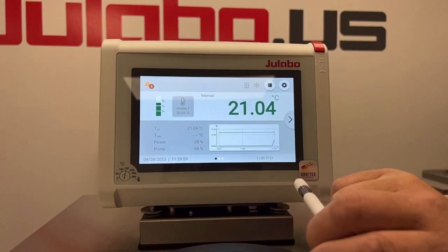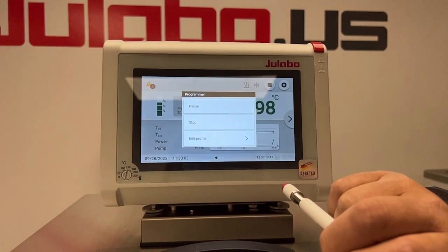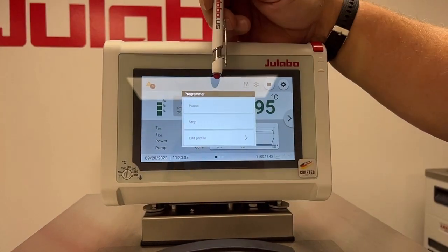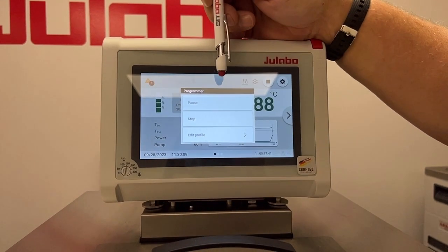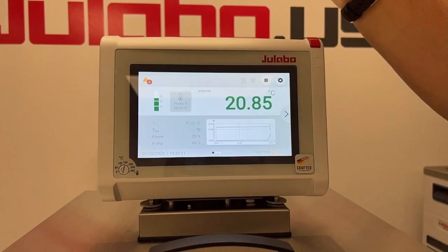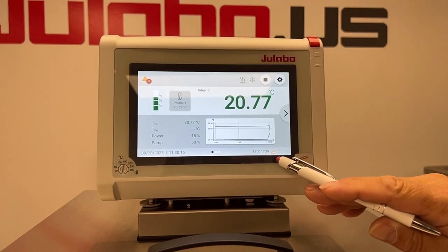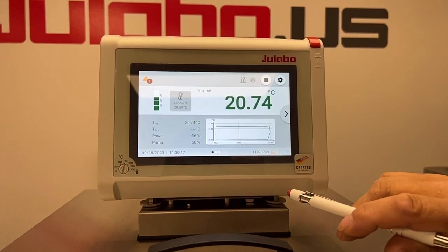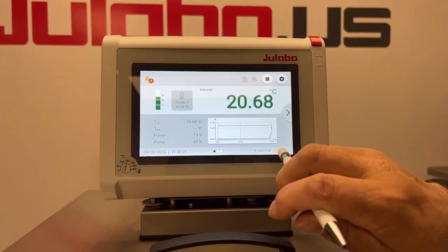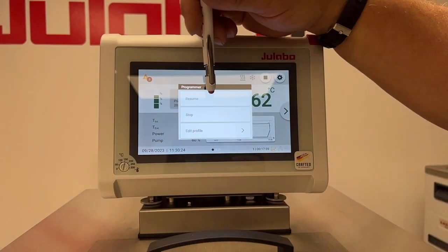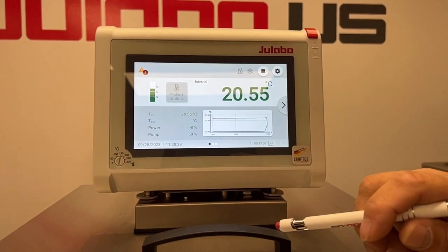So if for any reason you wanted to pause a profile, you press the flashing symbol, and you can pause, stop it, or edit it on the fly. If we pause it, the indicator changes to yellow, indicating that the profile's been paused and your timer stops running. You can resume and it will go back to flashing green.